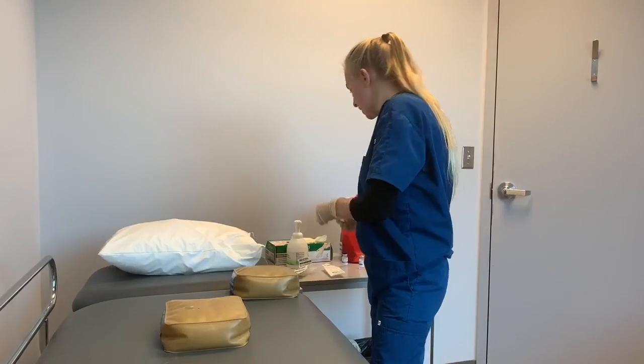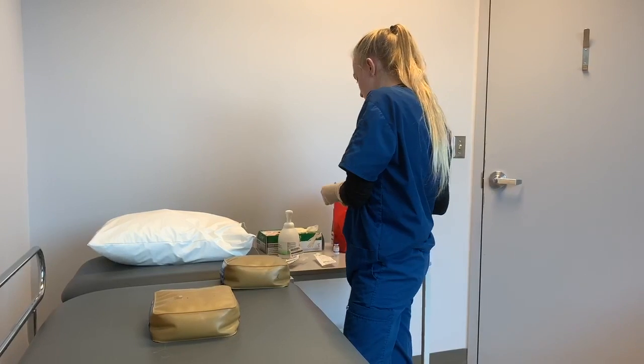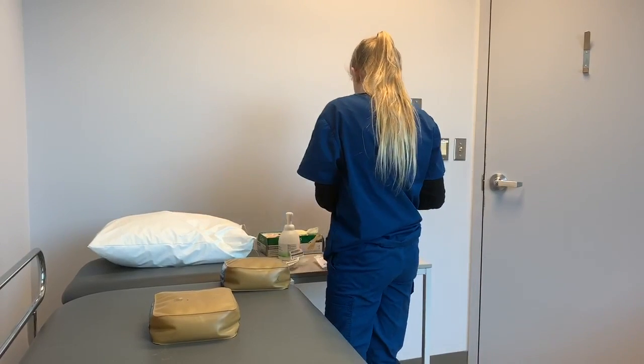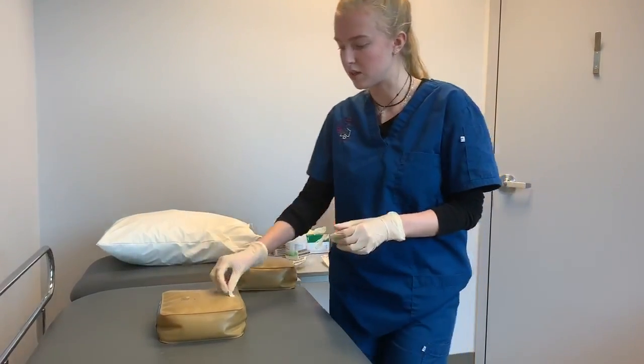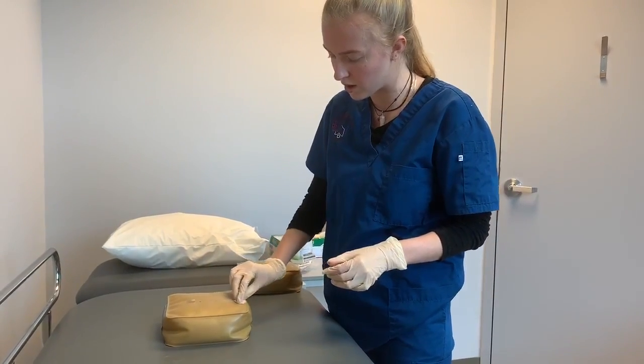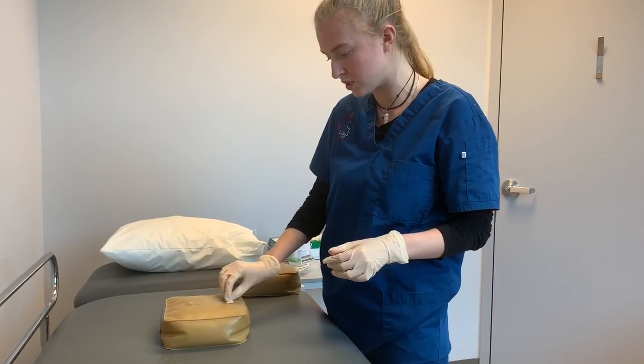Before doing my injection, I'm just going to clean the patient's abdomen. Okay, so I'm just going to rub with an alcohol swab in a circular motion for about 20 to 25 seconds over the injection site.